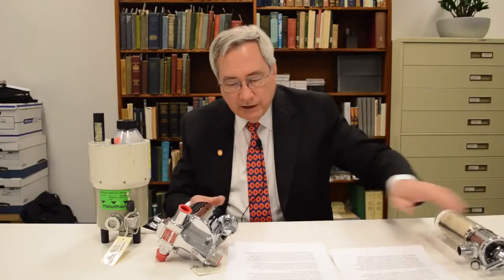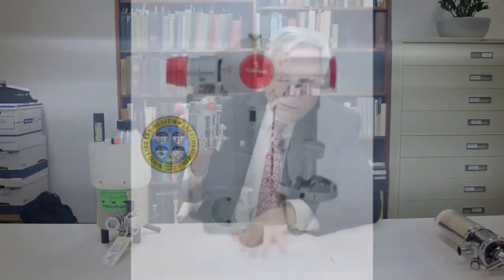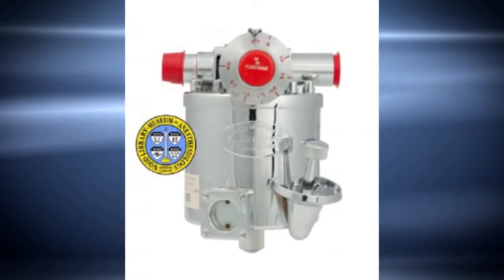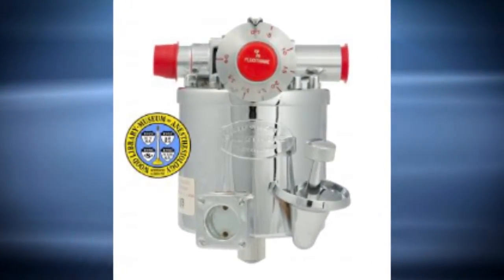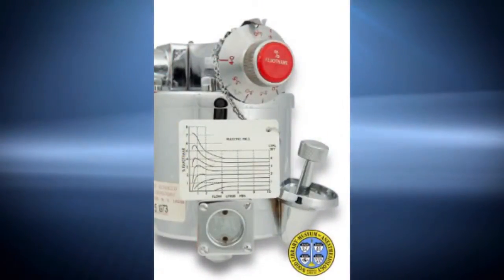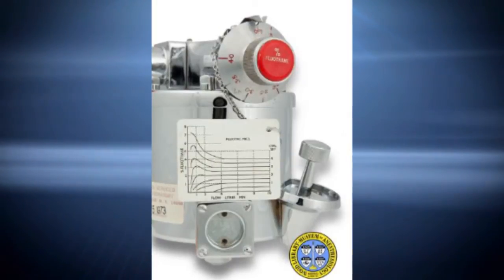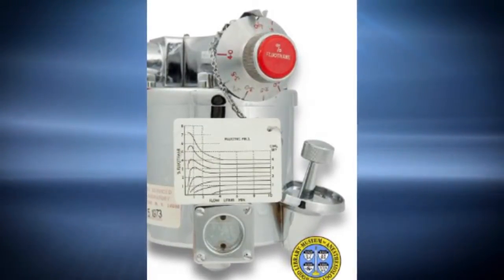The Fluotec Mark II dates from 1957. It's of English manufacture with distribution here in the United States. In contrast to the Ohio vaporizer, which, while intended initially for use with ether, could be used with other agents, the Fluotec was made only for use with halothane.